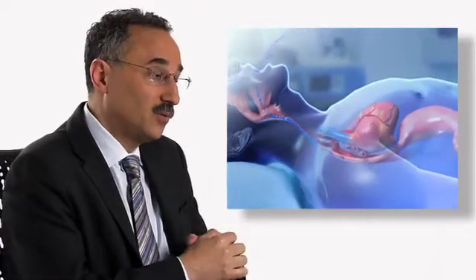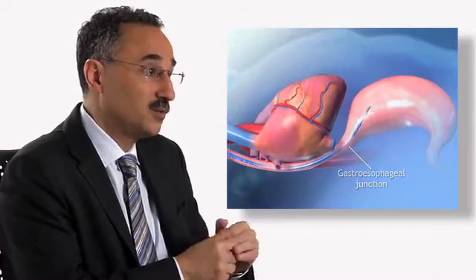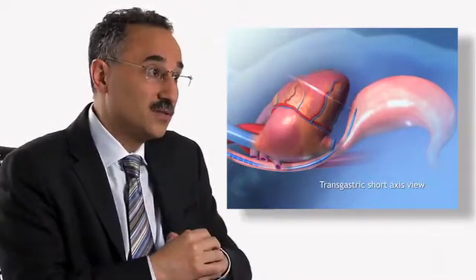There are commonalities across all of critical care, whereby hemodynamic management is central to all disciplines within critical care. hTEE in trauma critical care provides an online, real-time assessment that can be reproducibly performed. Having the ability to leave a TE probe in place for a prolonged period of time is a huge advantage, to be able to directly visualize and episodically assess those patients.